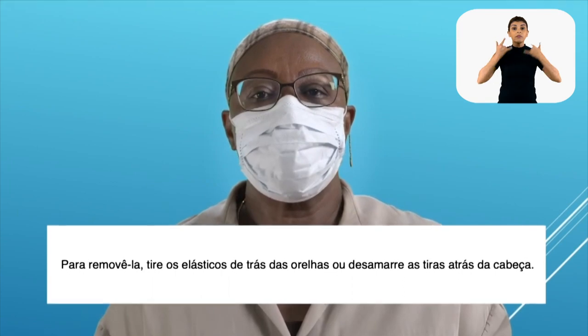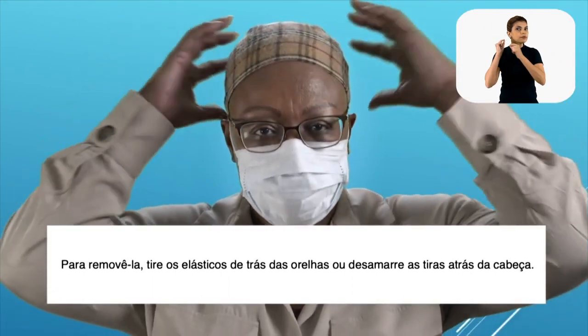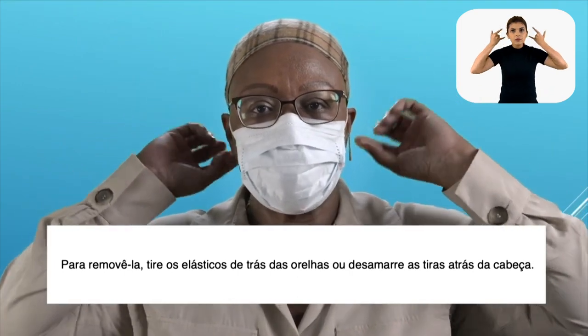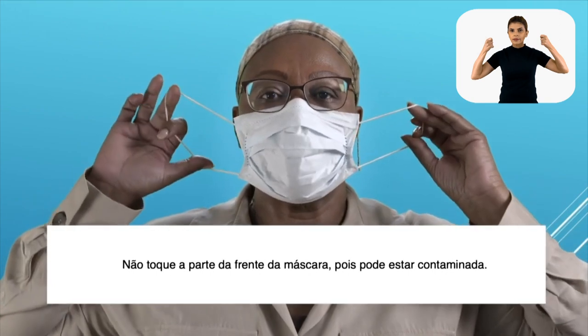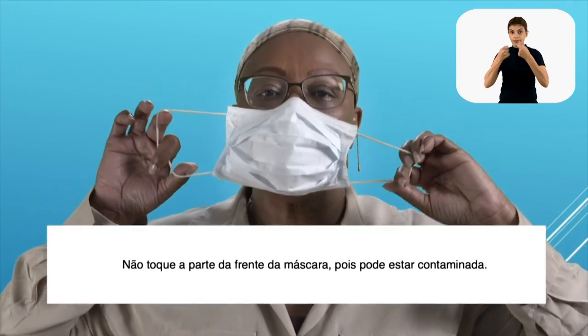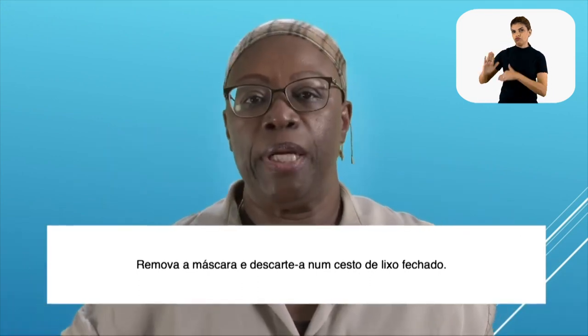To remove the mask, take the elastics from around your ears or untie the strings behind your head. Do not touch the front of the mask as it may be contaminated. Remove the mask and discard it in a closed bin.